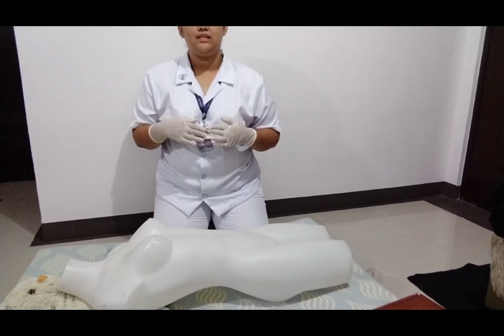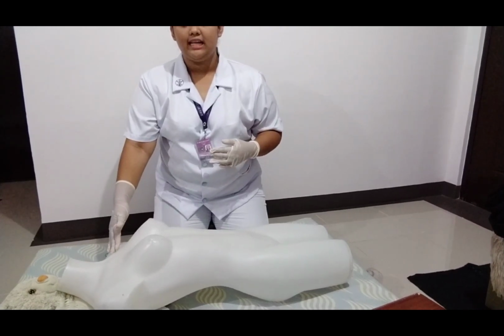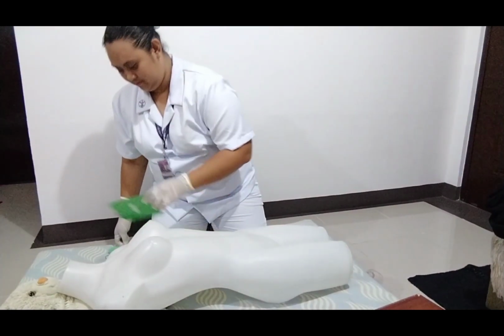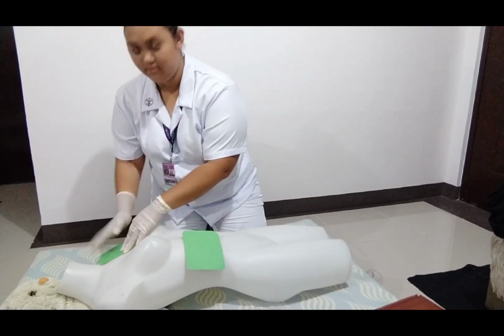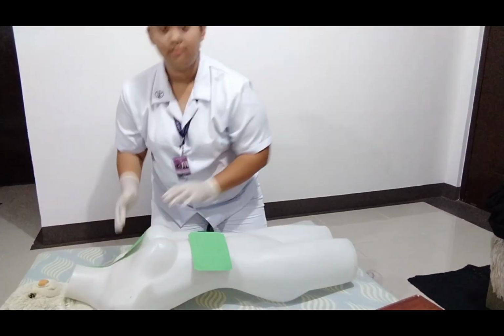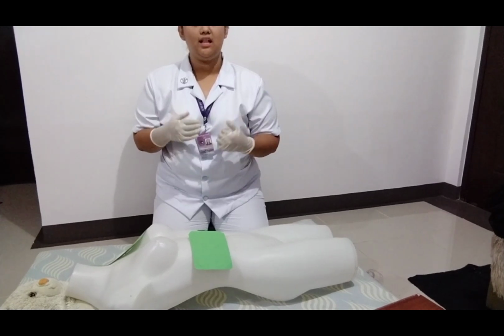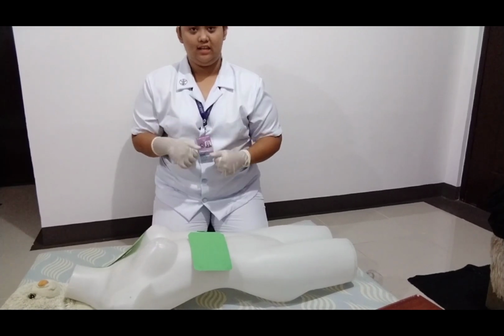So now I'm going to place the patches. One will go over the upper right area of the chest just below the clavicle, and the other one will be placed beneath, at the patient's armpit below the nipple line. Okay, so when we have placed the patches already, the AED will start analyzing the heart's rhythm, and it might tell us to stop doing the compressions and rescue breaths, so it is still analyzing.